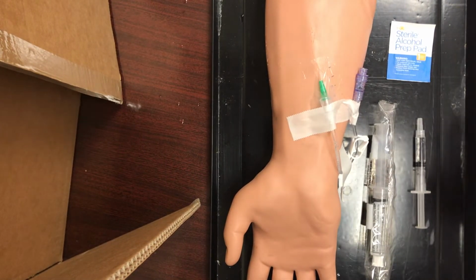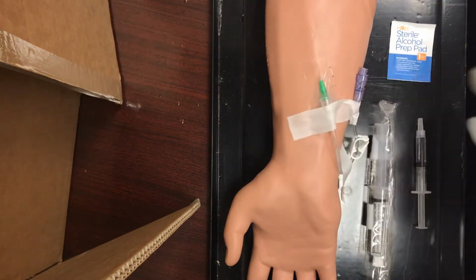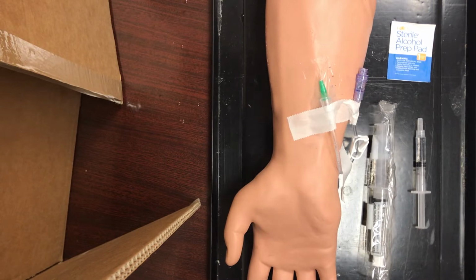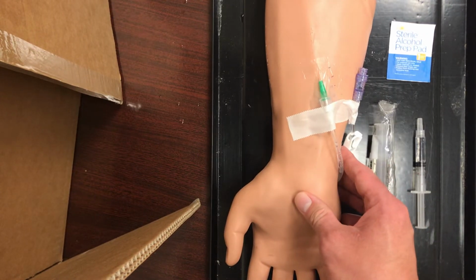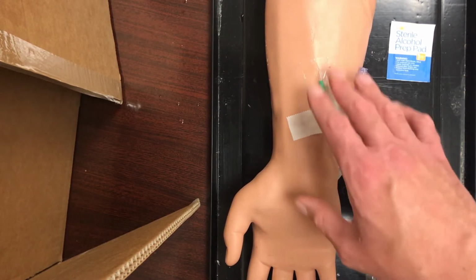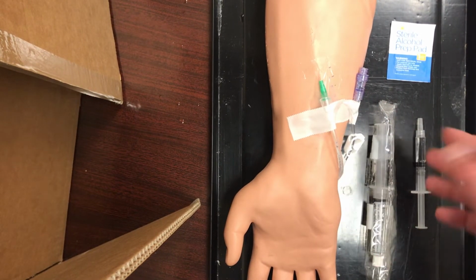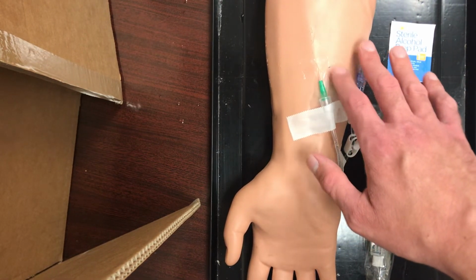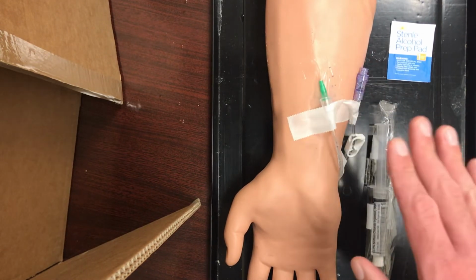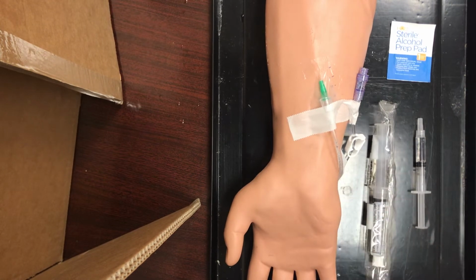Here we have our supplies. I want to make sure that I follow standard precautions. I have my PPE, so I have my gloves. Most likely we'll have a mask on because we're in the hospital. Eye protection if needed. Okay, we have our IV site here. We want to assess the client's IV site. We want to look for phlebitis, which would be any type of inflammation around the vein. So we're palpating around the area, asking if it's tender, looking for any kind of warmth. So we're looking at heat, any redness, swelling, or obviously pain.